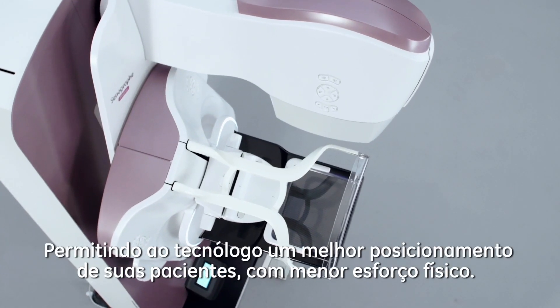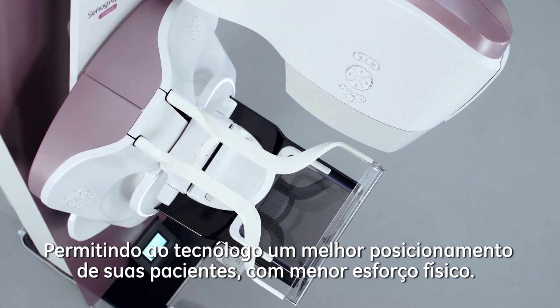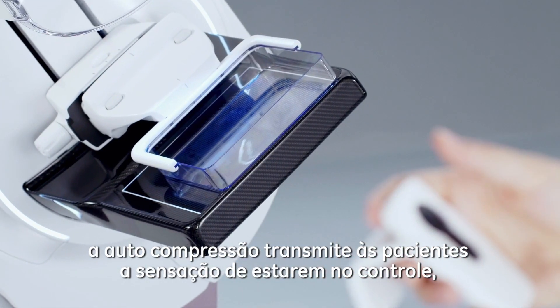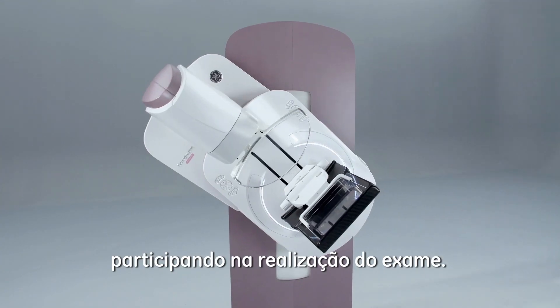The two-part position leaves ample space for technologists to position patients without any physical strain. Under technologist supervision, the self-compression gives patients a way to be in control over the examination by controlling the level of compression for their breasts.